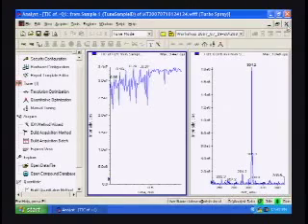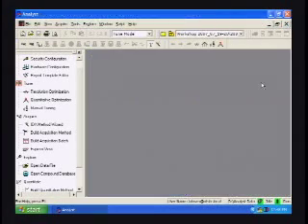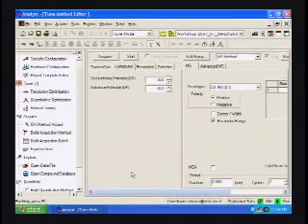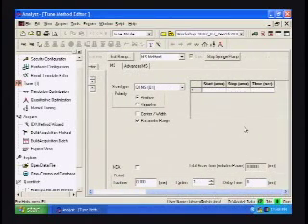We also normally will keep a copy of the pane of the fragmentation pattern, the total fragmentation pattern for each analyte, just so that we have it on record. Can you think of anything else? Okay. So we're going to go back into the manual tuning pane so that we can turn off our syringe pump. But this process, the optimization of parameters for cocaine, is finished. So now if you wanted to develop a method for cocaine, you have all your analyte parameters to use.